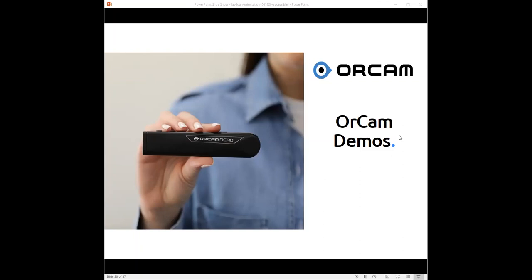Now I'm going to show you that there are two capture settings mentioned in the video. I'm holding up a blank piece of paper and I'm going to point at it. There's one that's like a cursor. It's shaped like a red arrow and it just points at a specific spot. If I want to change to the capture box, which is like a framed area that will be highlighted, that will capture specific text for me. I can switch by double-pressing, double-clicking quickly on the front button on the trigger button. Now I have a capture box. It's like a frame, four corners of a box to highlight what area I want to take a picture of.